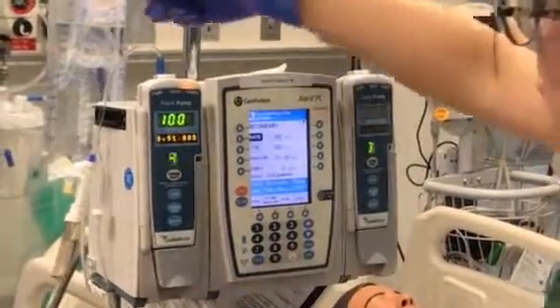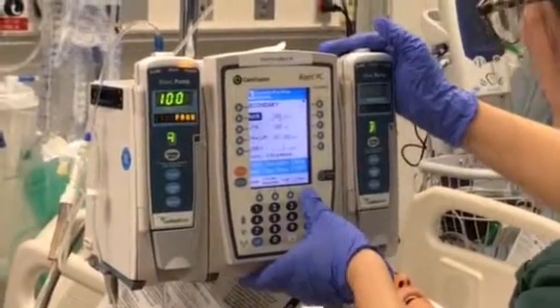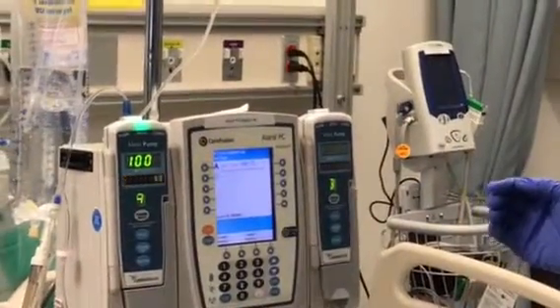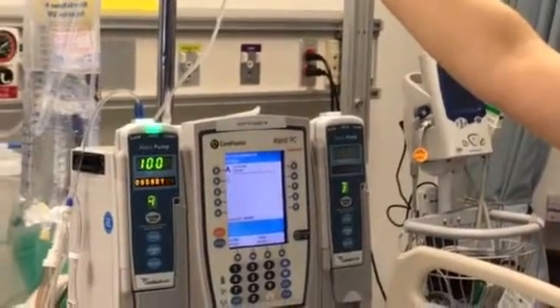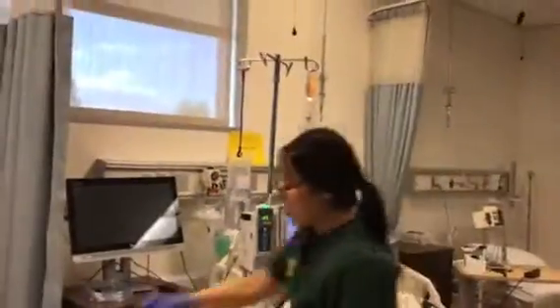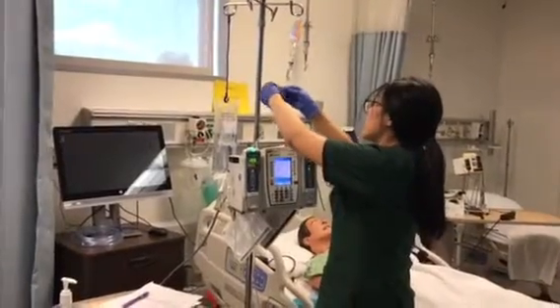After I check all these, double check the tubing again. Okay, it's connected to the patient, so we'll go ahead and start it. After I start, I will wait for the first drop of the medication. While I was waiting, I'll go ahead and label the bag here and label the tubing. The tubing will be good for 96 hours.